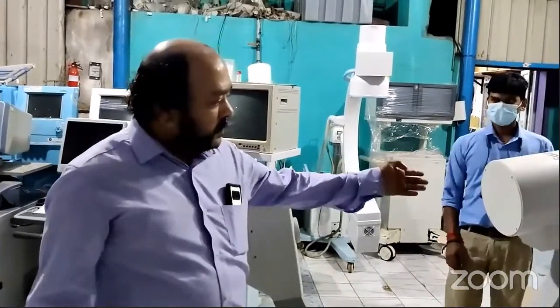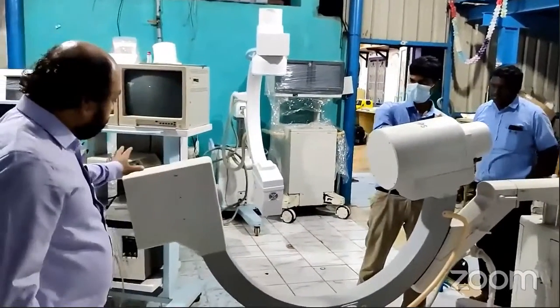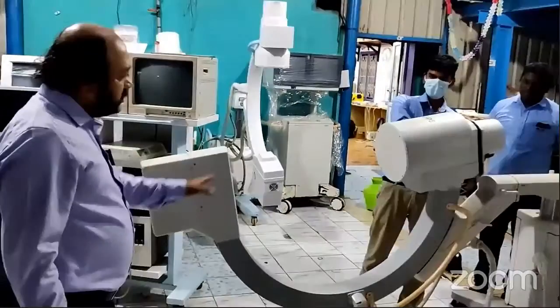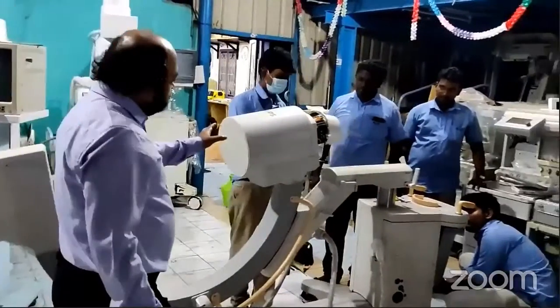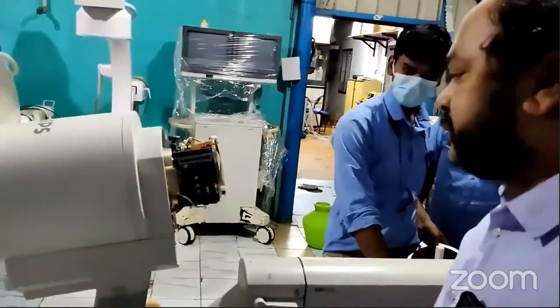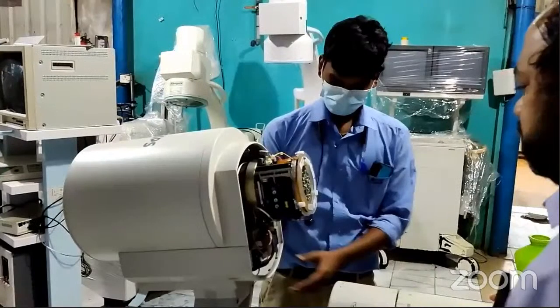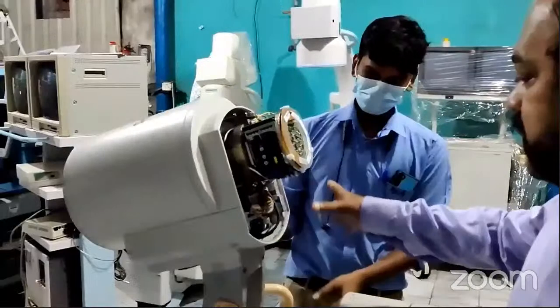Okay. So now we are opening one C-arm. First they are removing this IA part, the image intensifier. So you can see actually so many components inside the tube. This is a tube. Actually this is a tube.